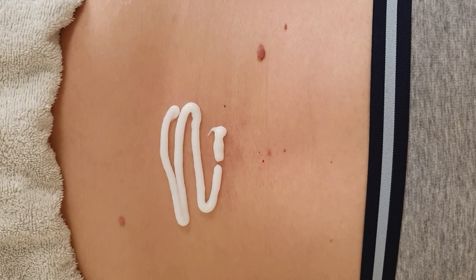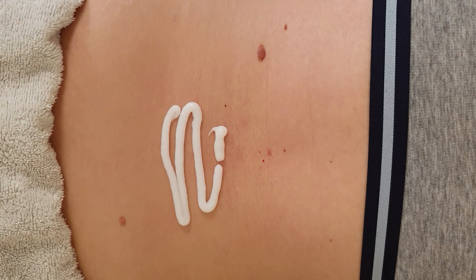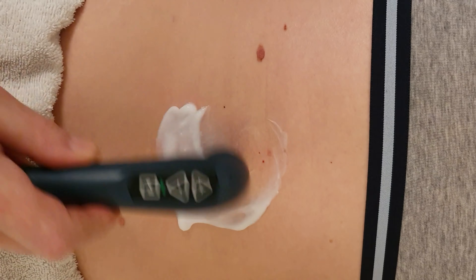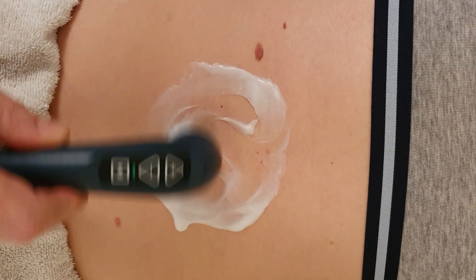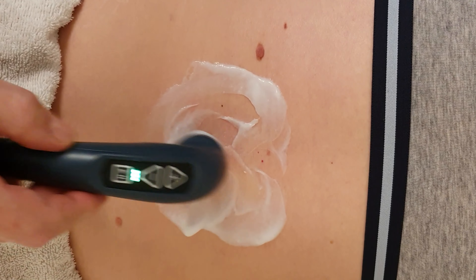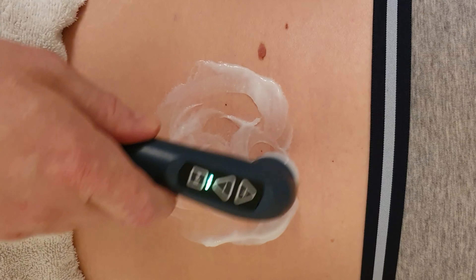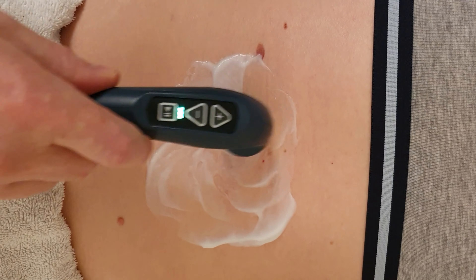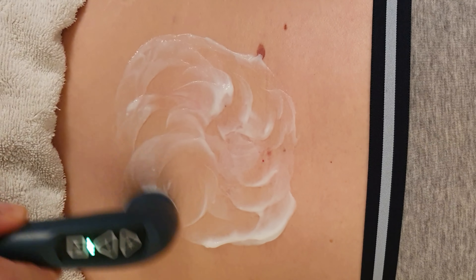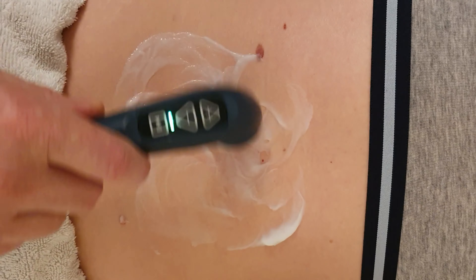I'll put a bit more contact medium on than I need. I'll bring the Tecar Pulse head in with its large treatment head applied and just spread that contact medium around a little bit. I want more contact medium than I need, just so when it dries out it doesn't become sticky. We'll start the treatment, concentrating on the muscles here, going around in small circles. You might find that you need to turn the treatment down if you get any hot spots — it might get too warm for the patient starting off at level 10.